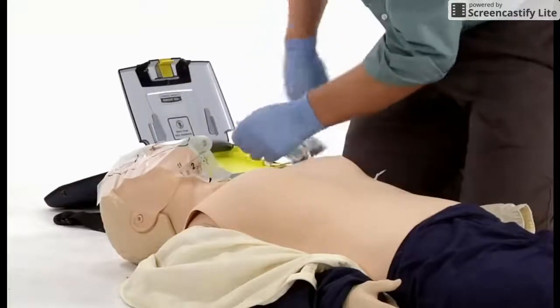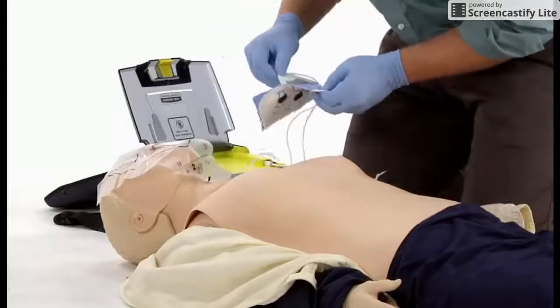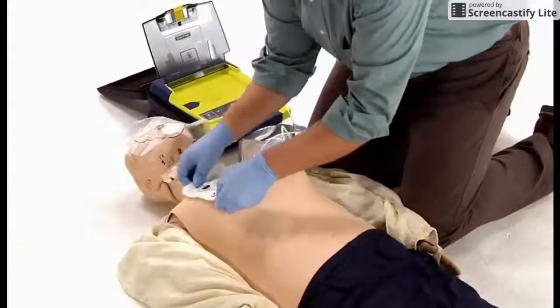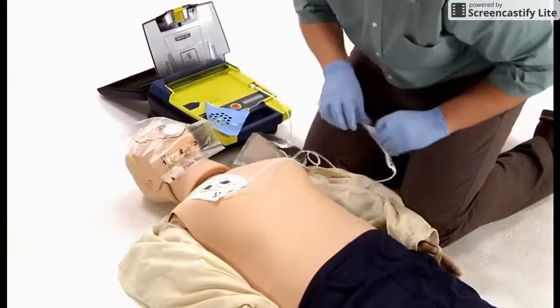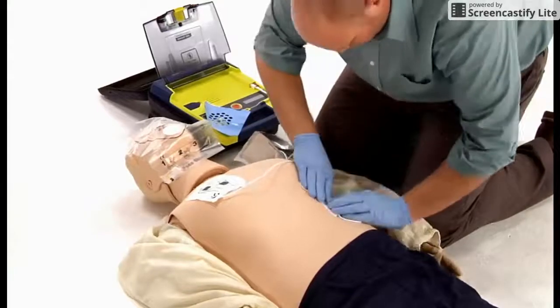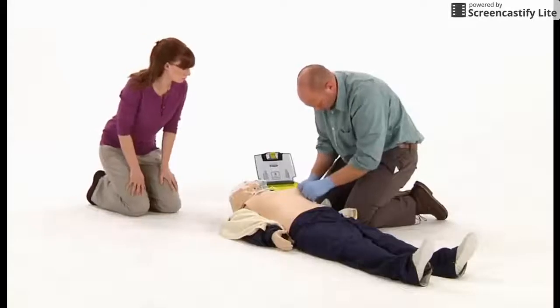Remove the pads from their packaging. Carefully peel off the backing from one pad and place the pad on the upper right chest. Place the other pad on the left side of the chest. Plug in the connector to the AED if necessary. The AED should start analyzing the person's heart rhythm.